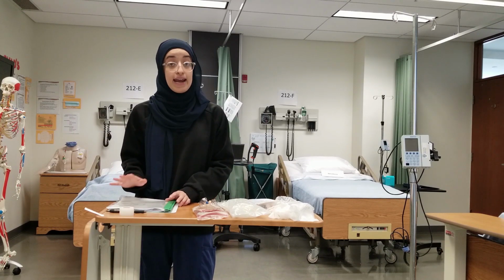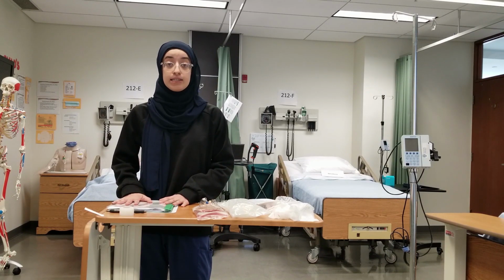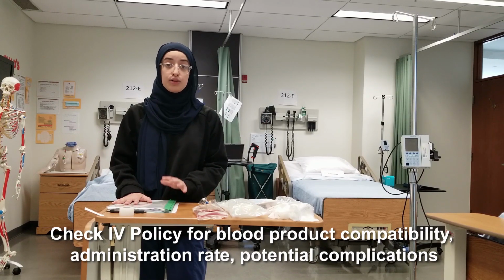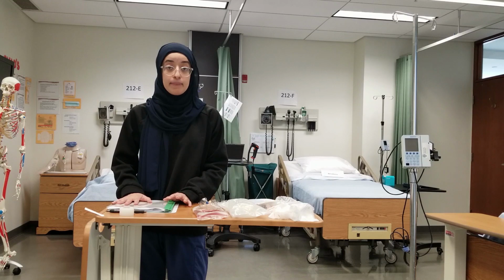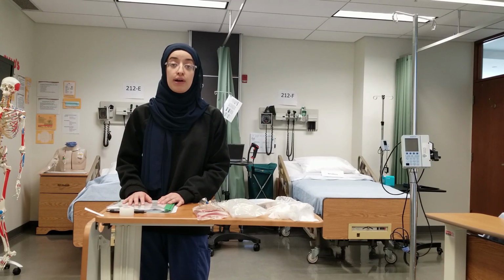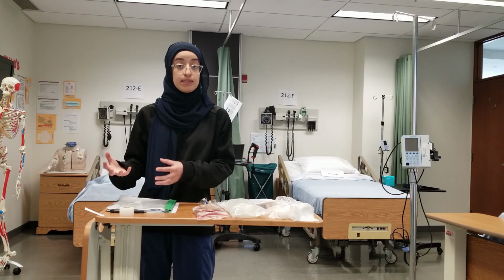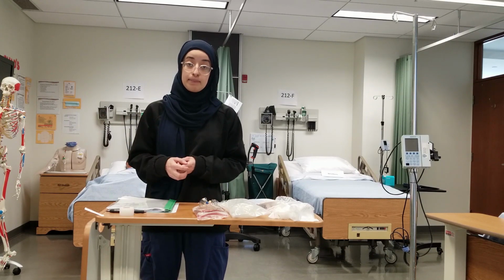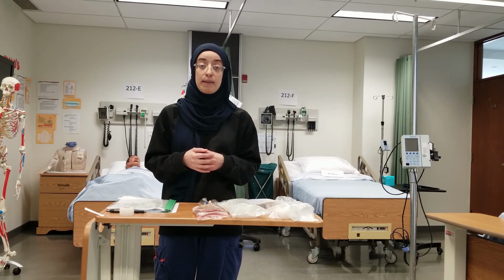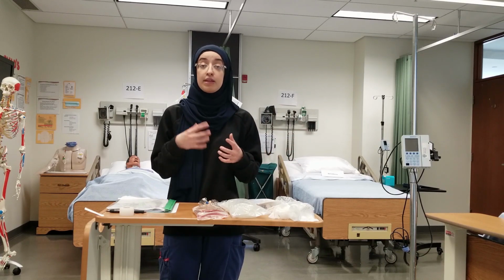I've also gone ahead and checked my Windsor Regional policy to see the different rules and considerations that I need to make sure of, including the rate, the IV compatibility, etc. So with Windsor Regional Hospital, it's super important that 20 minutes after I've received the blood from the blood bank, so I've removed it from the blood bank and brought it here to the floor to give to my patient, it needs to be infusing already.